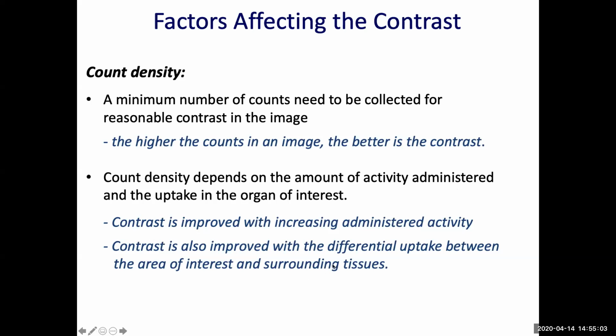Contrast is also improved with differential uptake between the area of interest and the surrounding tissue. This depends on the behavior of the distribution of the radiopharmaceutical you use, how it is taken up by the organ, different organs, and the surrounding area.